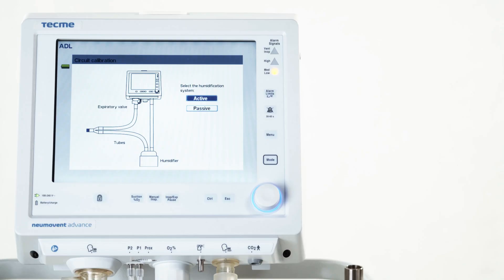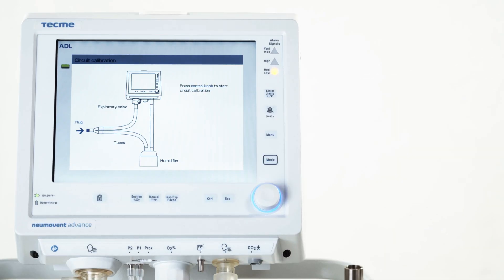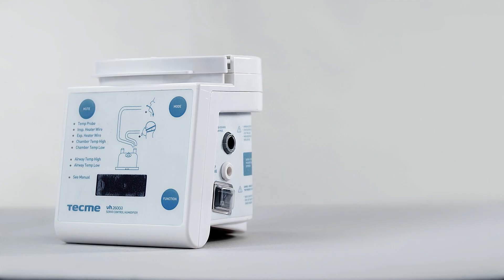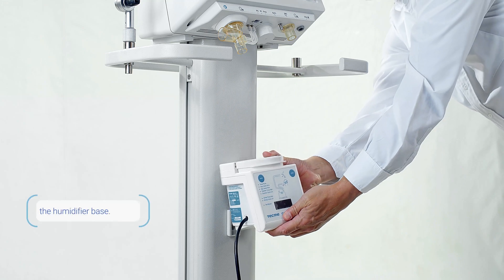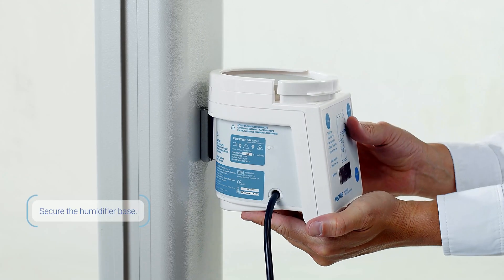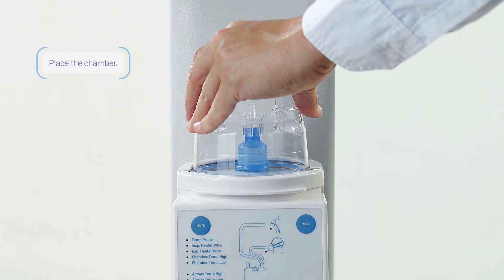When selecting an active humidification system, follow these steps to assemble the interface. Secure the humidifier base to the bracket on the trolley of the ventilator. Place the humidification chamber over the base.